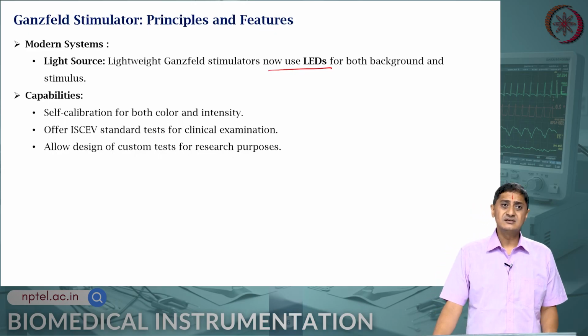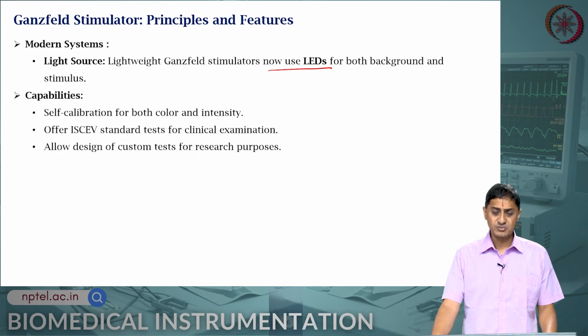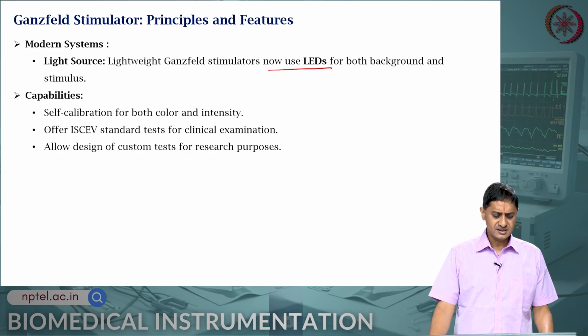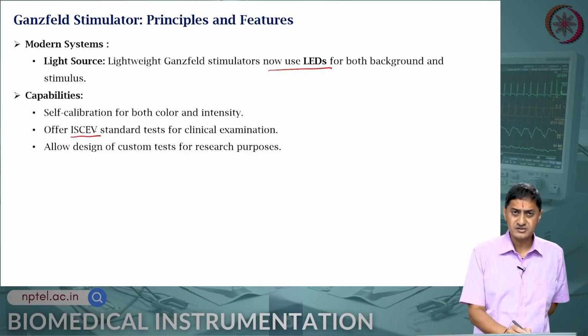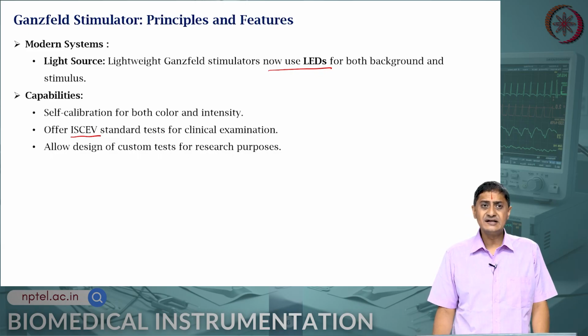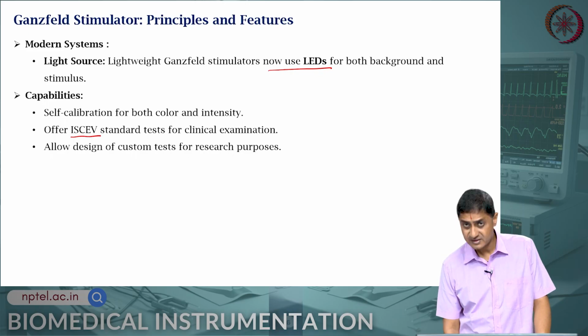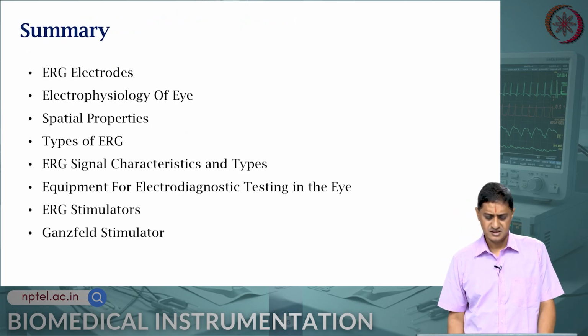The good thing with these kinds of stimulators is that they provide self calibration for both color and intensity. There are the ISCEV standards, the International Society for Clinical Electrophysiology of Vision, for clinical examination, and they allow design of custom tests for research purposes.